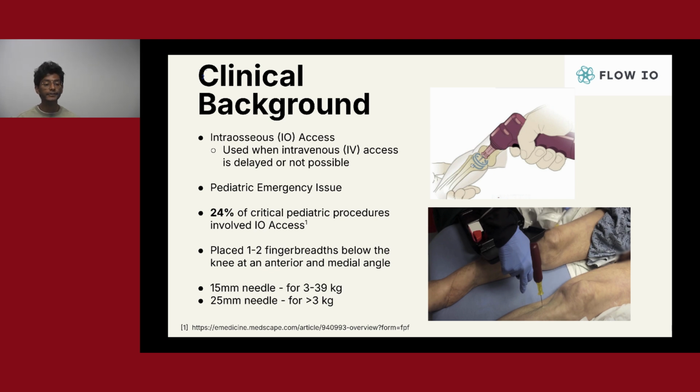An IO needle is often used in pediatric emergency situations because children's veins are small and IO needles are the fastest method of access. Notably, 24% of critical pediatric procedures involve IO access. An IO needle is drilled 1 to 2 finger breadths below the tibial tuberosity at an anterior and medial angle as shown in the figures.